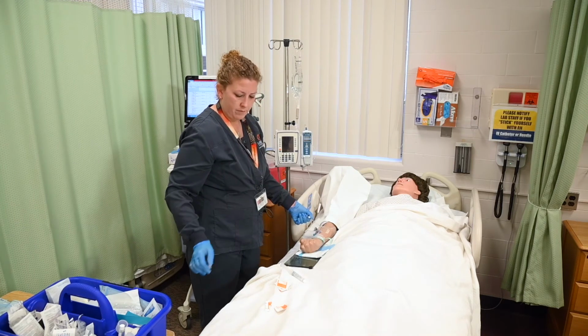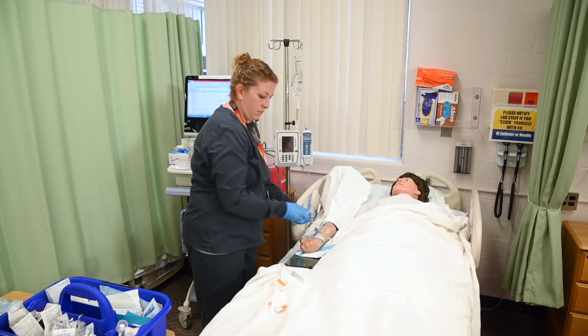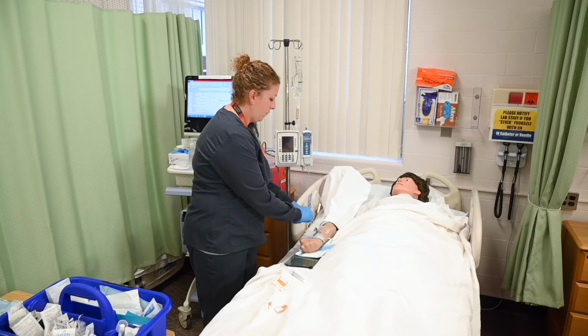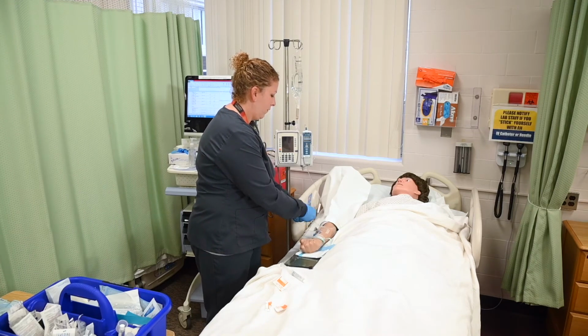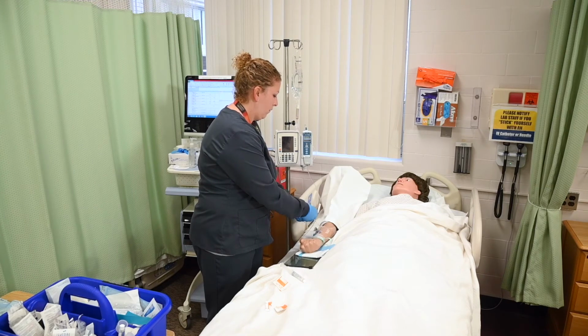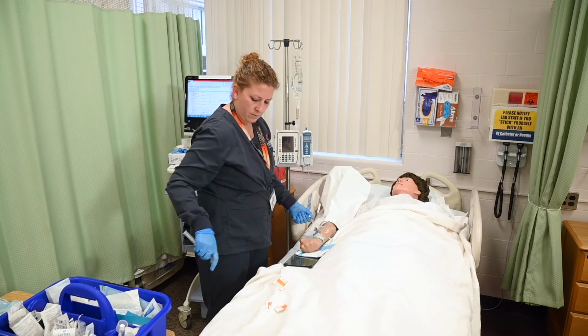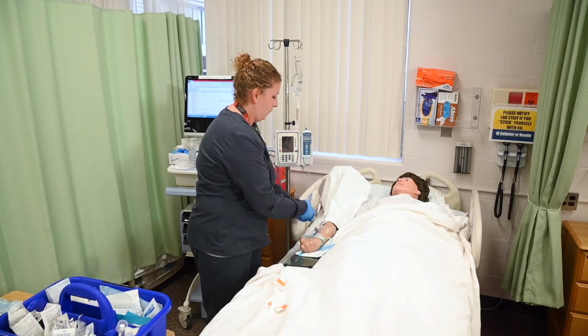Disconnect the syringe. Clean the injection port with a new alcohol prep pad and allow it to dry. Attach a new normal saline flush and inject at least 3 mL, or 10 mL if the medication and primary fluid are not compatible, which is the case. So she's going to use the 10 mLs at the same rate at which the medication was administered.